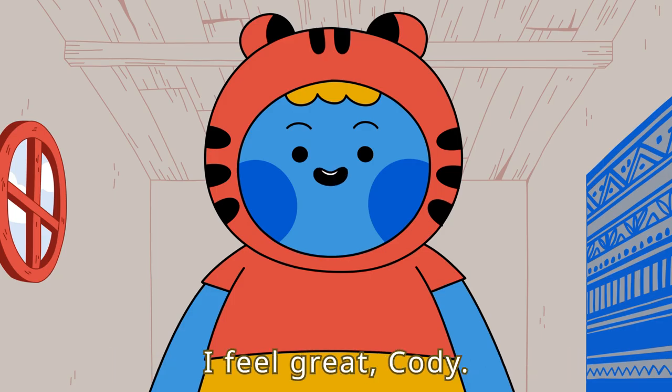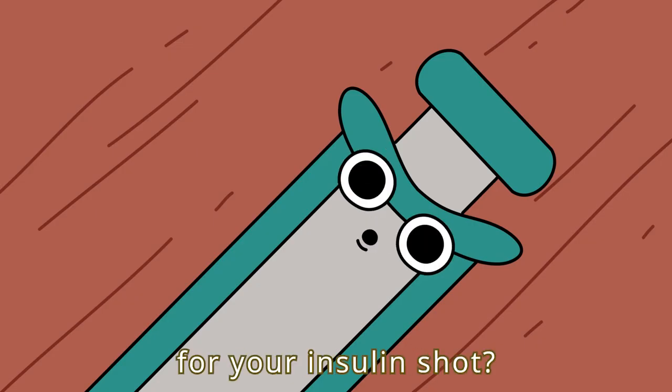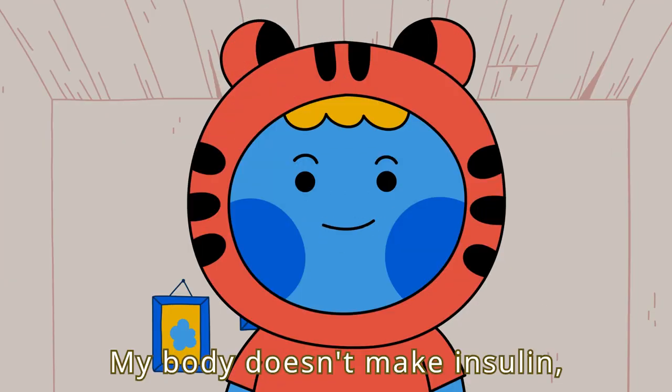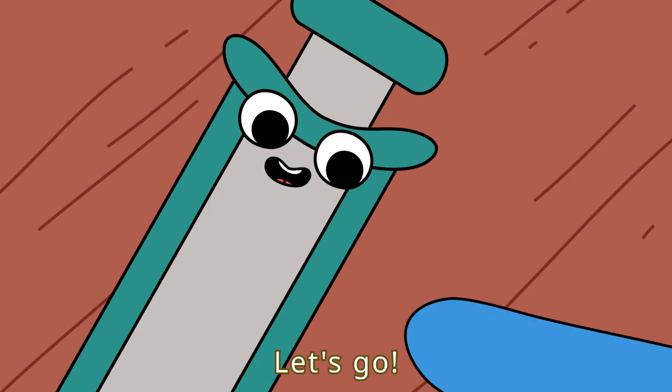How are you doing today, Betty? I feel great, Cody. Are you ready for your insulin shot? Ready if you are. My body doesn't make insulin, so I need to inject it. Let's go!